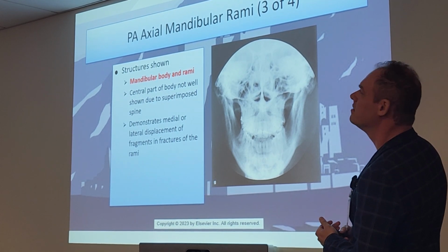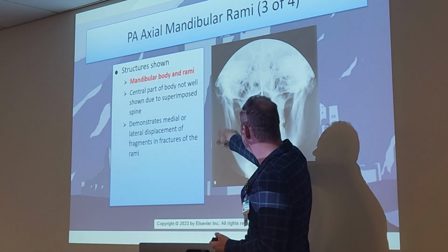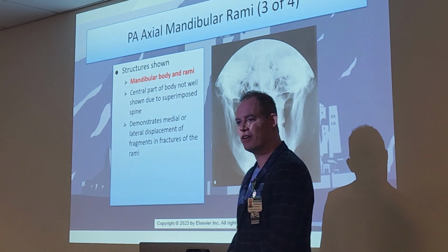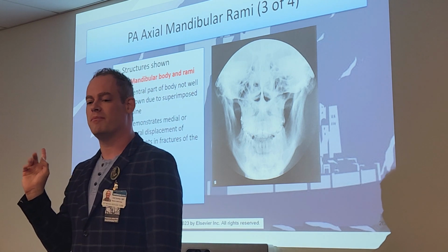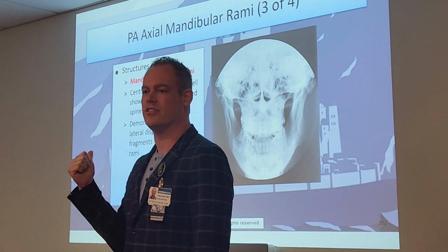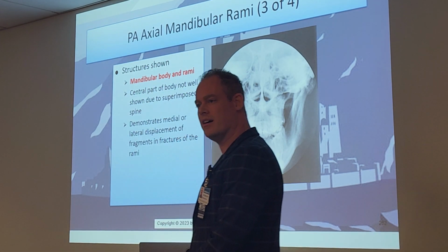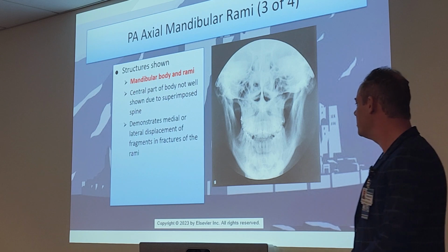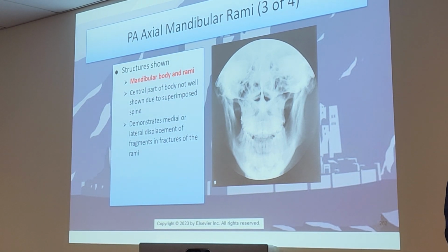What are those artifacts on the right side? So like right here, the pepper stuff. Probably dust, I'd guess. So one thing with film x-rays, that was a really aggravating thing about film is that dust particles and dirt always got inside the film. They would show up like little flecks, like little snowflakes. Because it's in the anatomy as well. Were there a lot of misdiagnoses? Sure, if you had an incompetent doctor, yes.